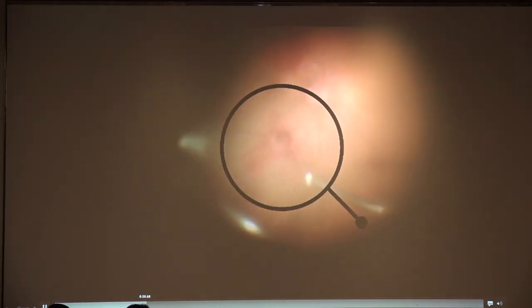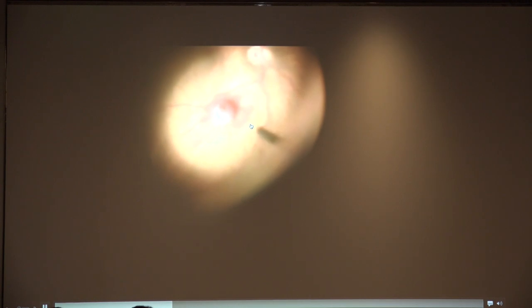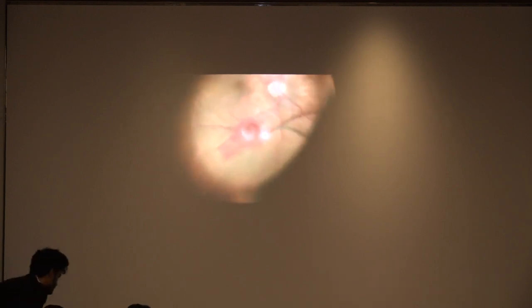So we gradually removed the vitreous hemorrhage, clearing it little by little. Here in the posterior pole, there was this mound sort of a thing. I think Dr. Bikramjit is here maybe, or he's not here at the moment. So we had this mass here, nice and round and almost mushroom shaped, but thankfully there was no retinal detachment next to it, so I didn't know what to do at this point in time.